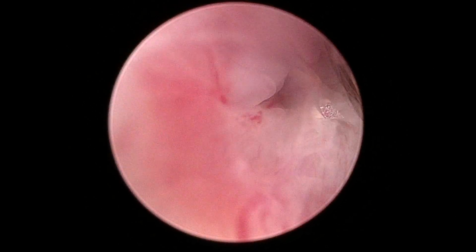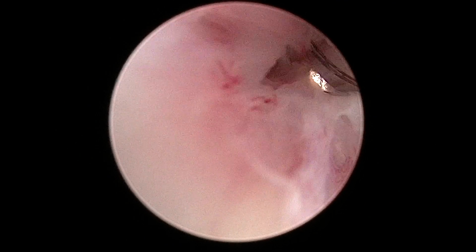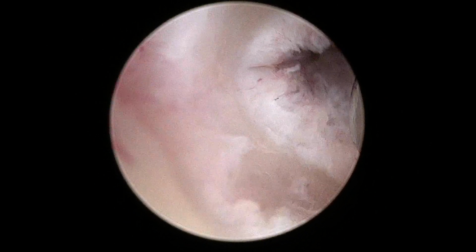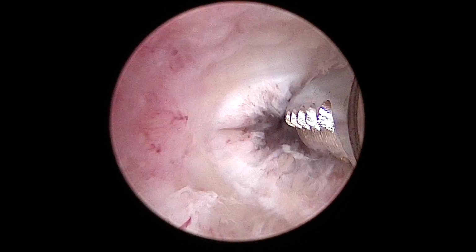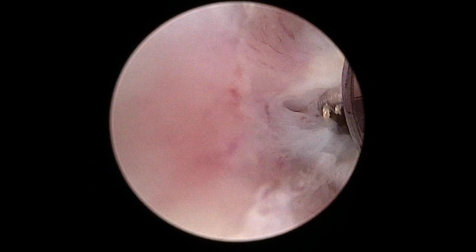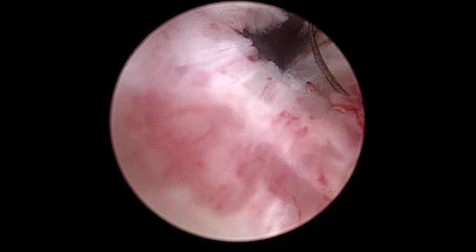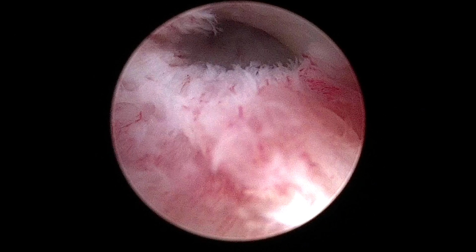We introduce the incisor blade into the stenotic part, and with judicious use of the suction which is on the handpiece and circumferential cutting, we open up the stenosis gradually and steadily. We also use a combination of the bevel of the scope to move ahead. But as we go ahead, we enter further stenosis just below the internal os, and here we use the circumferential cutting and judicious use of the suction. Not too much suction is applied to prevent pain.